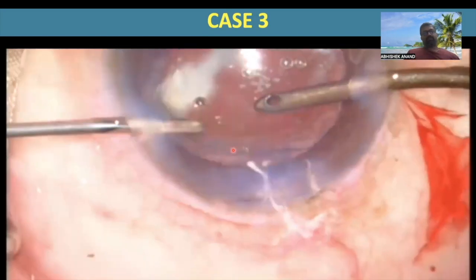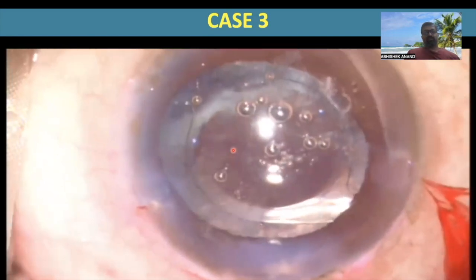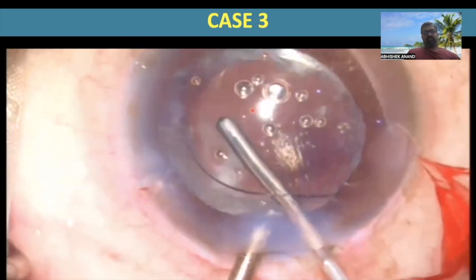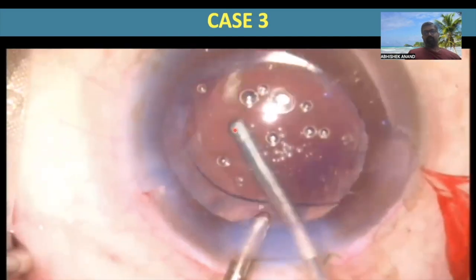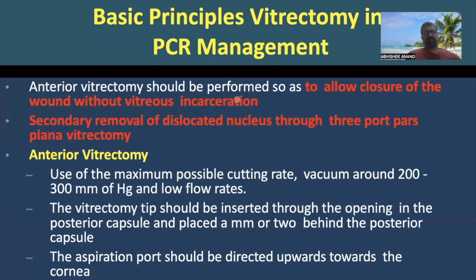This triamcinolone acetonide can be used to delineate any vitreous and should always be used whenever accurate delimitation of the vitreous fibers is required. We should not be dependent just on naked eye examination.